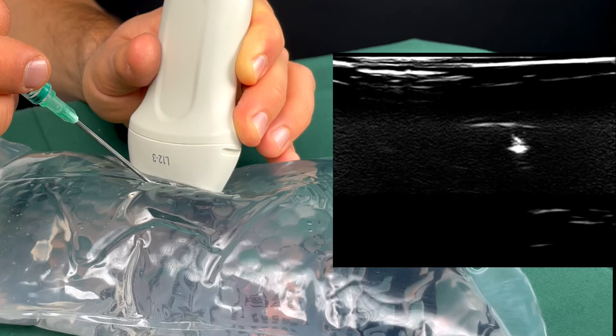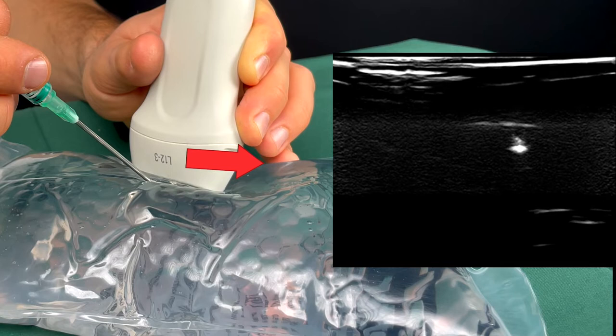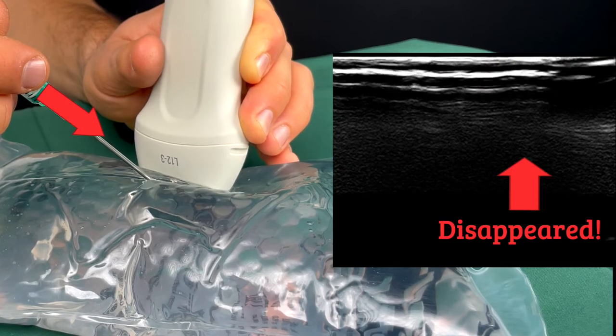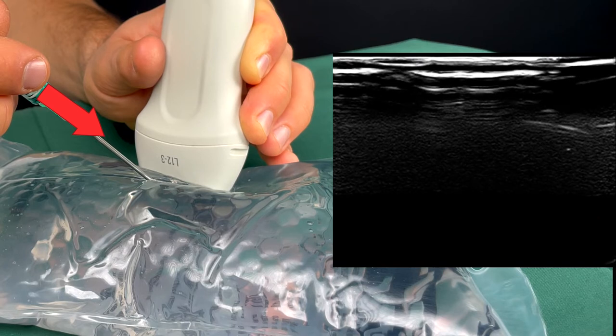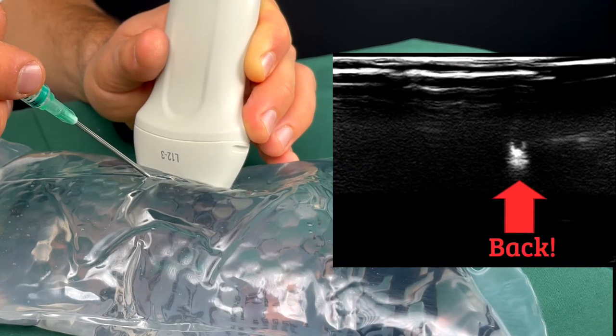However, this can be mitigated by consistently using dynamic tip visualization. Basically, you move the probe away until you no longer see the dot, then advance the cannula until you see it again. We rarely use this for central lines, but it does have its use for arterial lines.